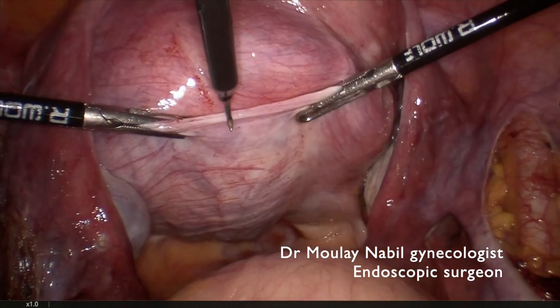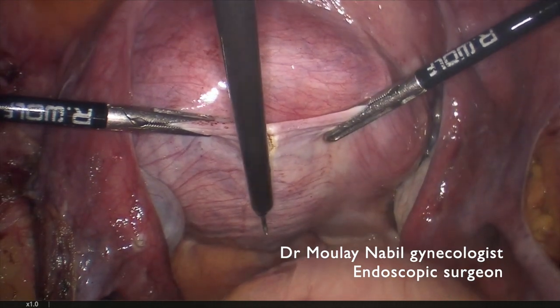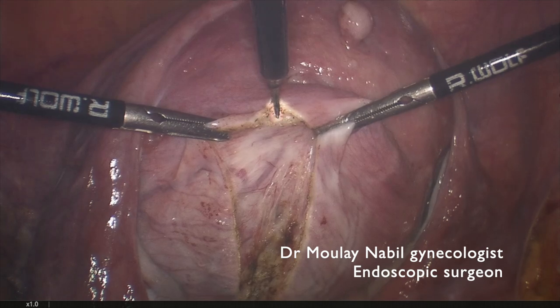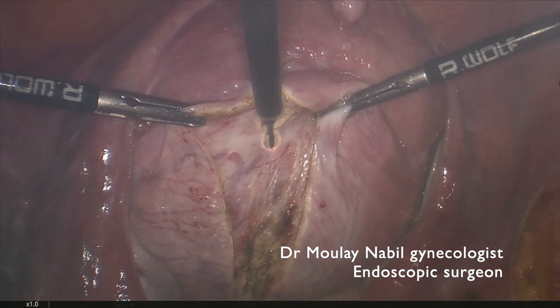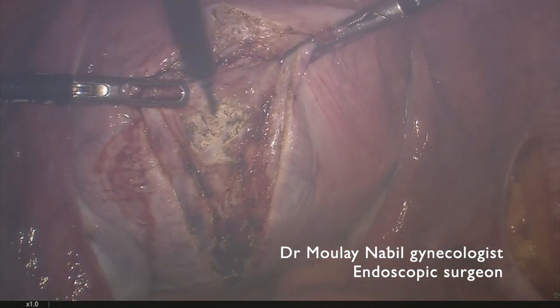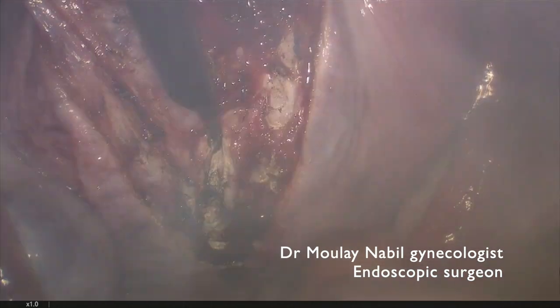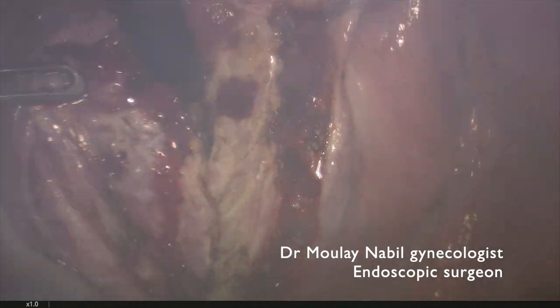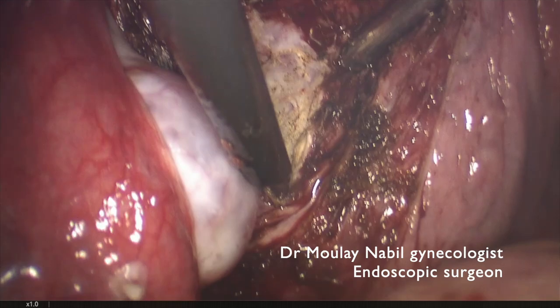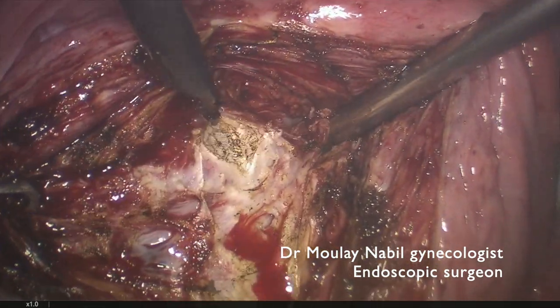We will now begin the myomectomy. We use a monopolar needle and will perform a longitudinal hysterotomy. Our goal is to reach the myoma and to cut the pseudocapsule surrounding it. Even though the myoma is a very large one — 10 centimeters in cervico-isthmic position — the bleeding is quite acceptable. We cut until we reach the myoma, then use the monopolar needle to cut completely through the pseudocapsule.